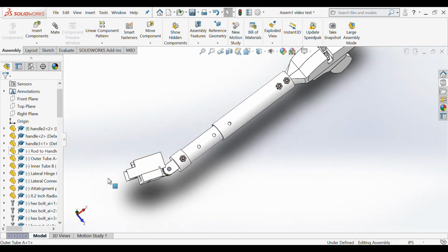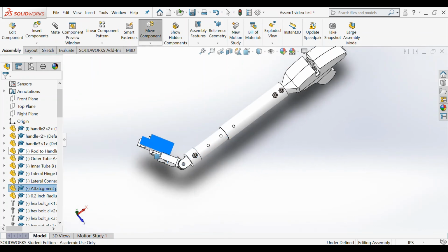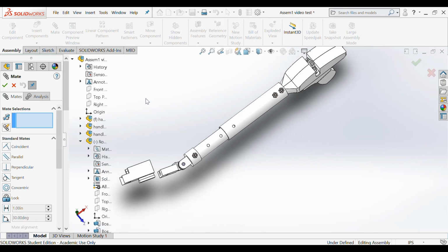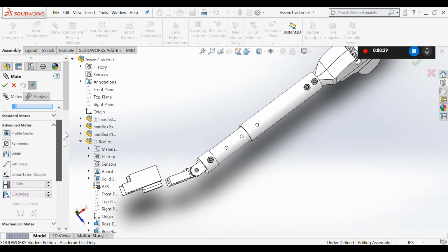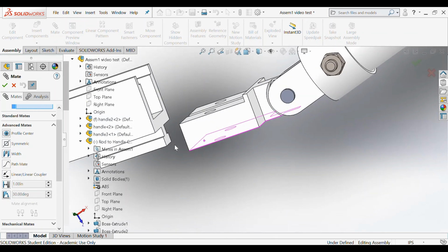Next, I'm going to rotate this guy. So what we're going to want to do is, as you can see, we can drag this attachment piece, but it can also move backwards. So we're going to want to restrict that movement. So we're going to go to Mate, and we're going to go down to Advanced Mates. And we're just going to limit its movement. We're not going to fully constrain the piece.